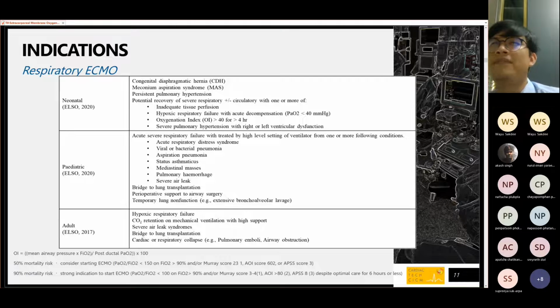I mean trauma from forcing flow to the lung, and the lung becomes much more injured. So we make the ventilator less and take over by using ECMO, and wait and see until the lung comes back.